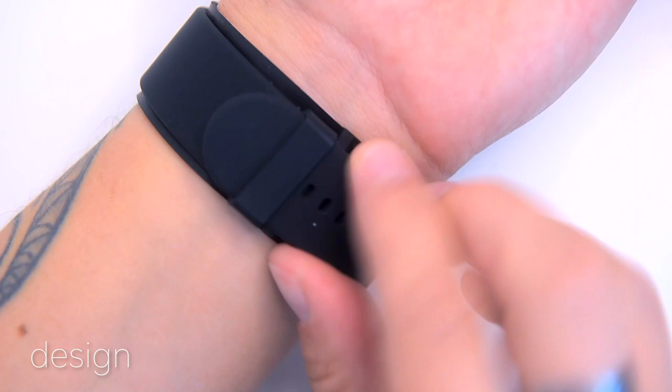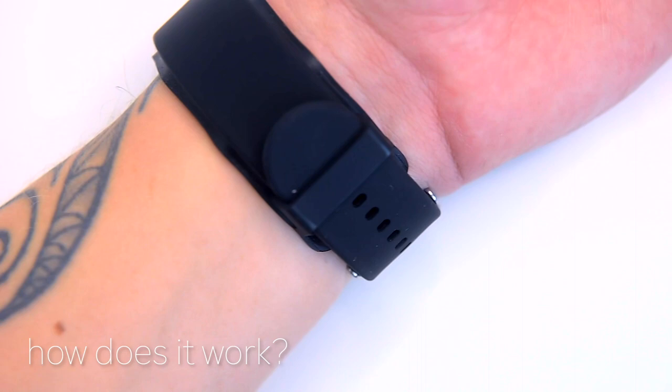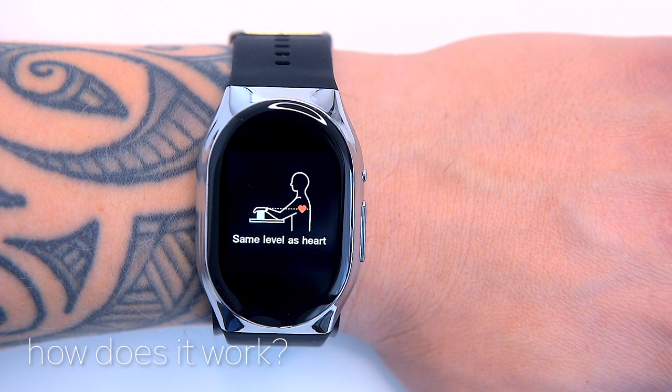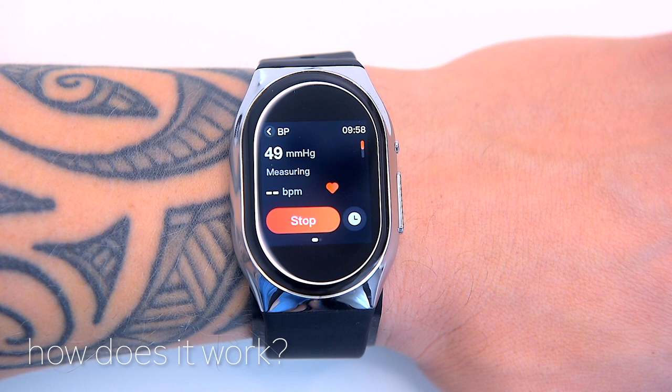How does it work? Tell the BP Doctor Pro to do its thing and the wrist strap will physically tighten around your wrist over the course of exactly one minute. The wrist must be held over heart level. The BP Doctor Pro starts pumping — it feels hard as the strap physically tightens around your wrist. It takes exactly one minute to reach the peak squeeze before it lets out a chirp and deflates, instantly displaying your blood pressure reading and heart rate on the watch. If your figures are fine you'll see a green circle; if not, it's red. If you move about during the process, it stops and alerts you.